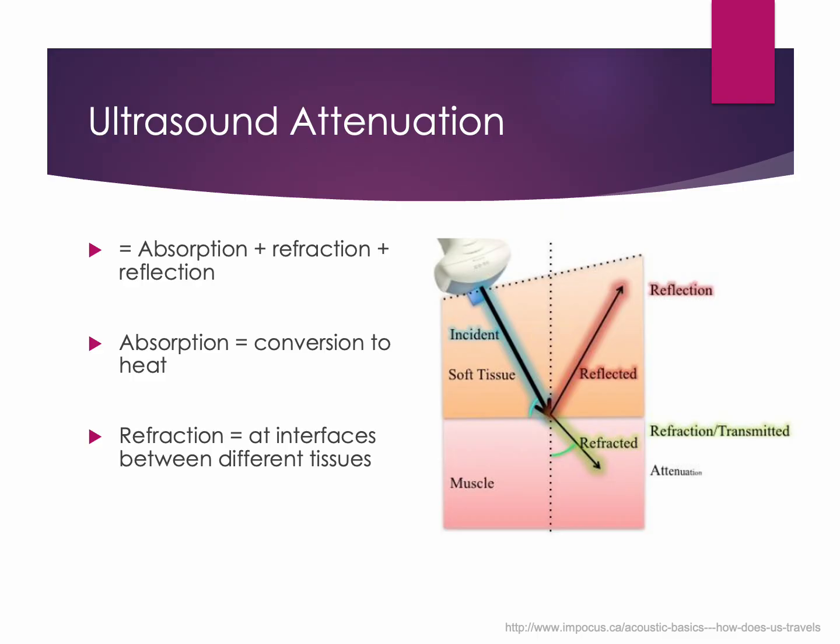When we talk about attenuation, we're describing how ultrasound energy is gradually lost as it travels through tissue. This concept is critical because it determines not only how deep the ultrasound can go, but also where and how much heat is actually produced. There are three main ways this energy is lost: absorption, refraction, and reflection.